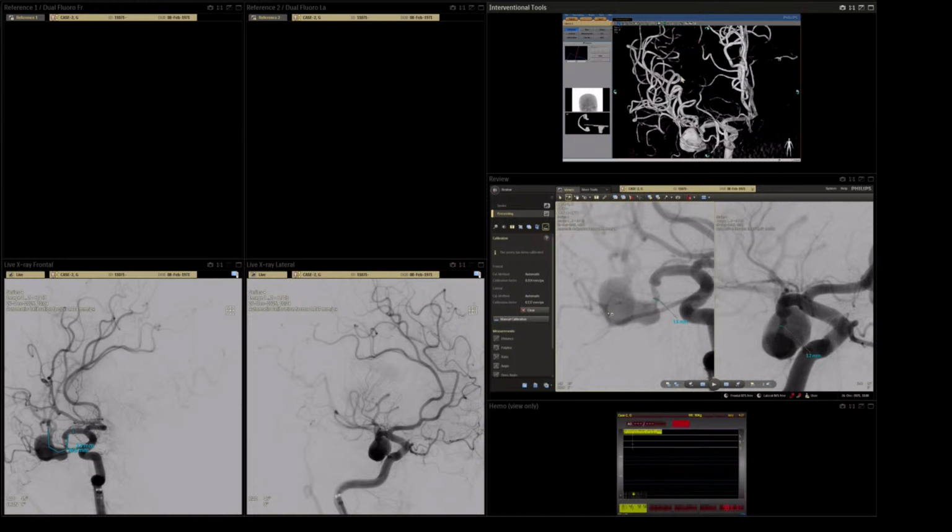We will take 225 by 15. I think it's okay. Xeon Blue.